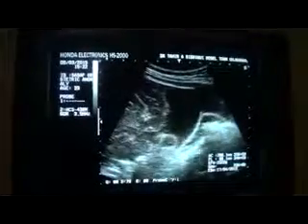This is the brain tissue within the cystic area, and this is the cervical region.